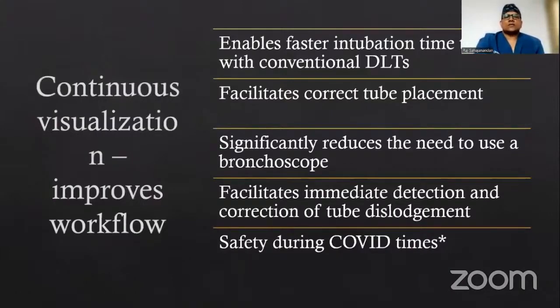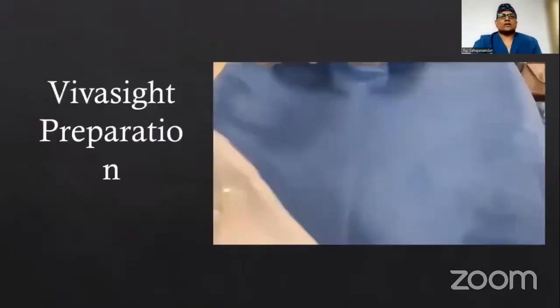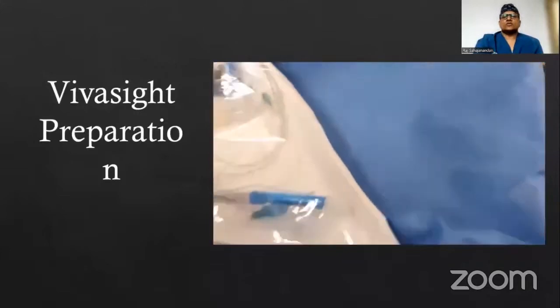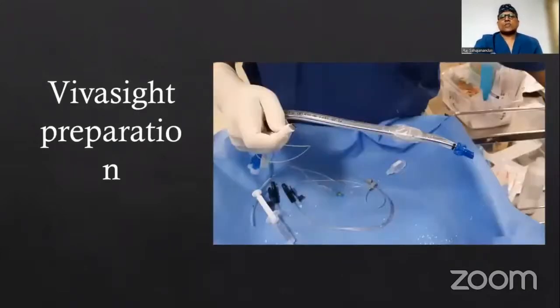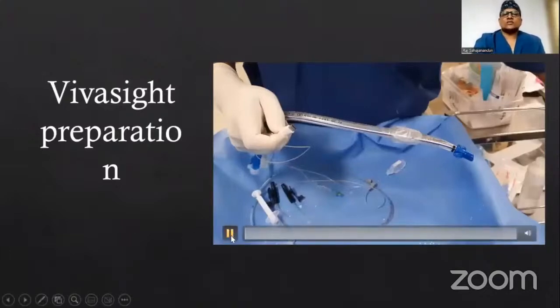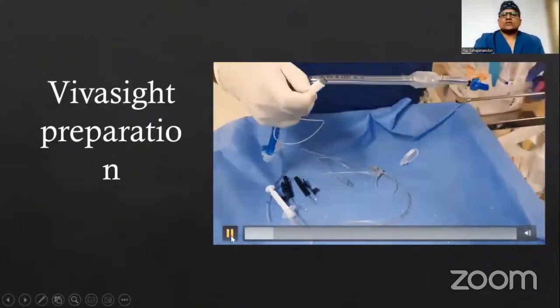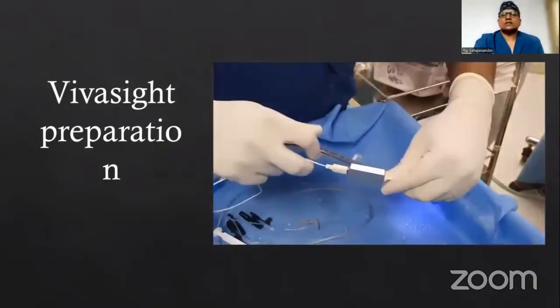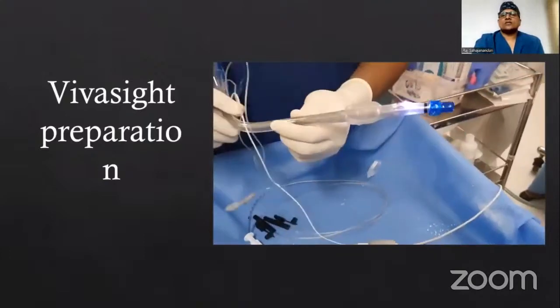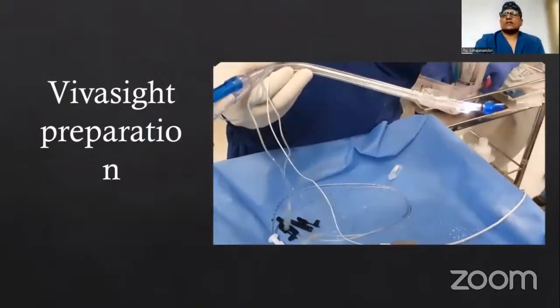I have used it. You don't need a fiber optic, and the incidence of malposition is very less. We found it very useful during the COVID times where we were worried about the fiber optic and aerosolization. This preparation part, I will not go into too much because I just want to show you one picture of when you connect it. This is how easy it is. It automatically detects. Once you connect it, the light comes up and you can see the image on the screen.